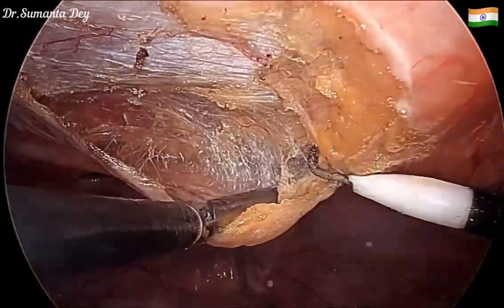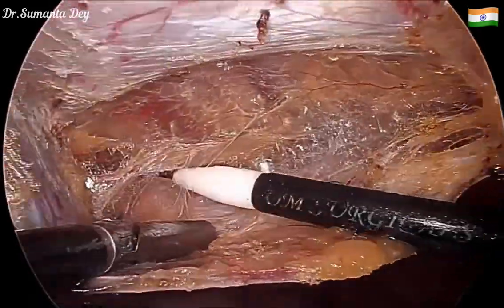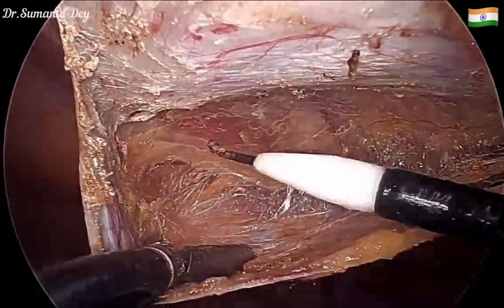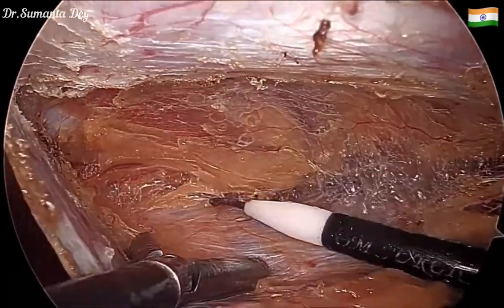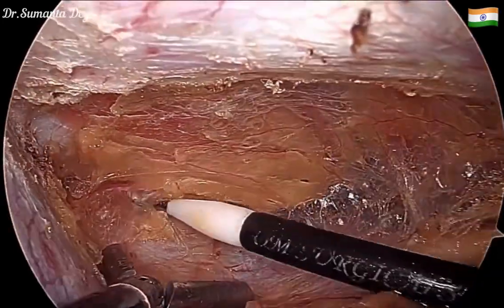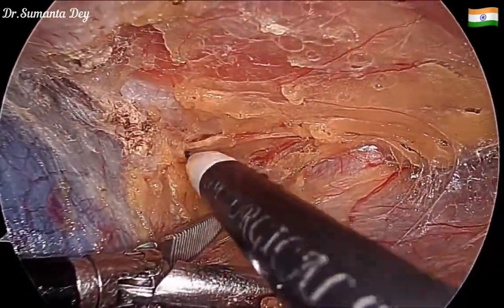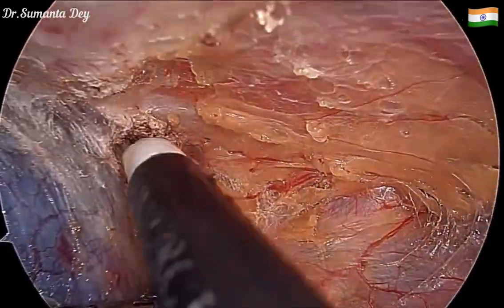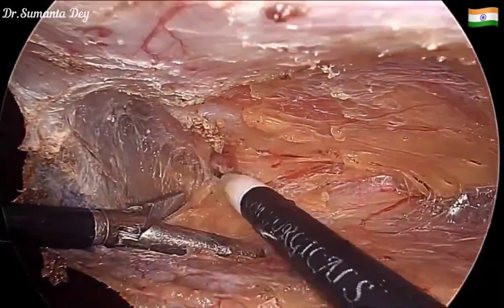Raising that part becomes easier once I go down towards the hernia side. In this patient, I'm standing on the right side and dissecting on the left side. Going further, I'll be able to see the inferior epigastric vessels — that vessel should always stay up.